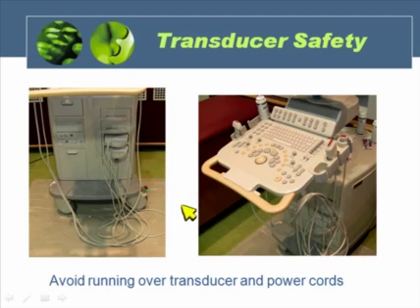so please hang your transducers where they're supposed to be. Also, most of the manufacturers now have hooks to hang the wires and cables of the transducers. Leaving them on the floor like this invites the chance that the transducer cords will be run over by the machine.